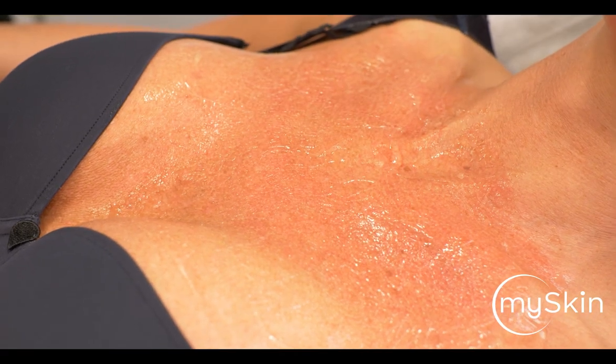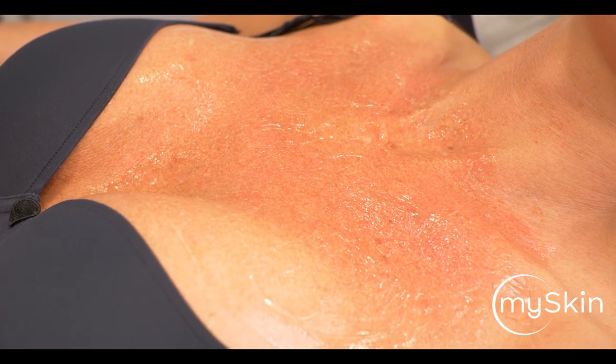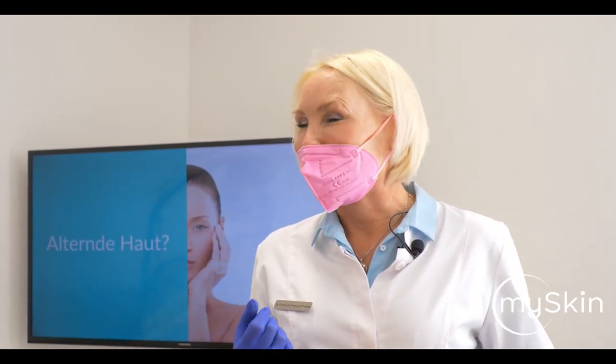What we can do to give an extra glow is combine this with a Frax 1940 treatment. We will have open channels in the epidermis which allow us to penetrate active ingredients like vitamin C and antioxidants into the skin. This gives us a little extra for the patient. We always try to educate our patients to focus on the decolletage and on the hands at the same time as the face, because otherwise we see quite a difference between the changes on the face and the rest of the body, and this doesn't match at a certain point. That's why it's so important to treat those areas as frequently as we treat the face.